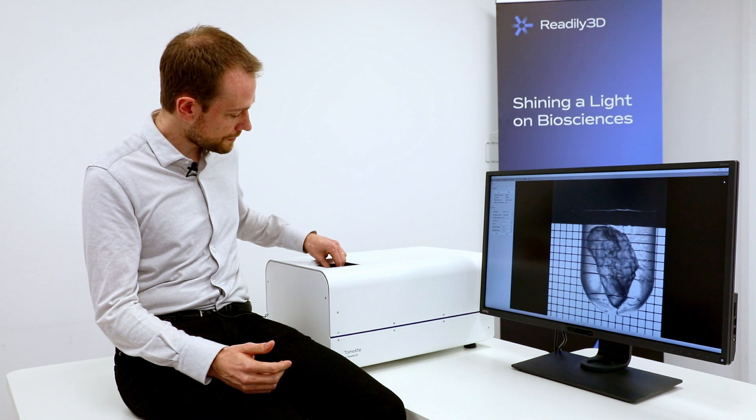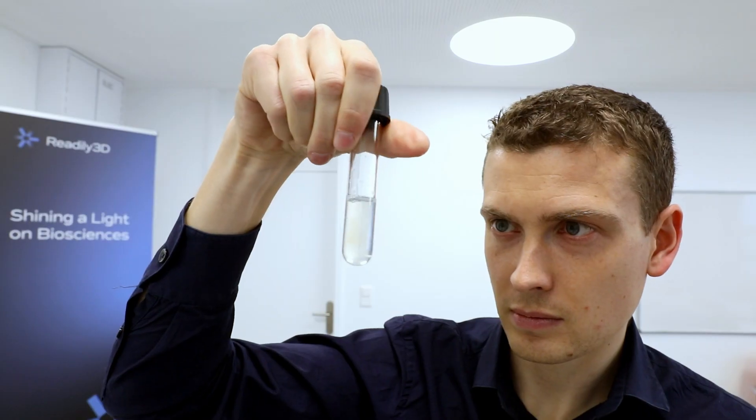We print inside sealed containers, which maintains a sterile environment.